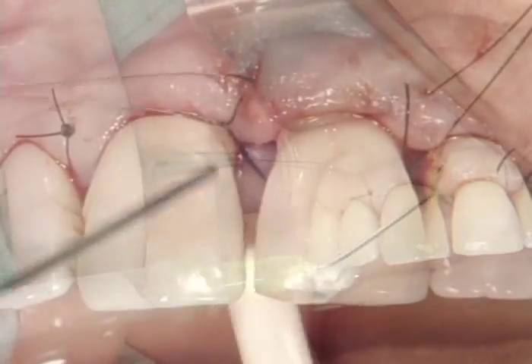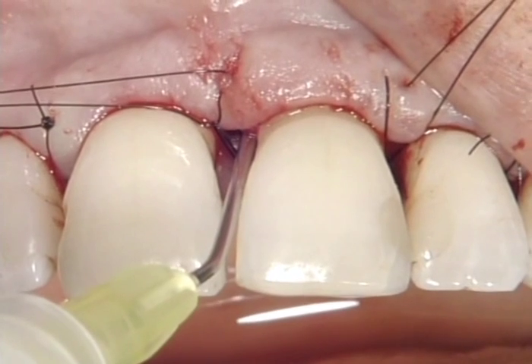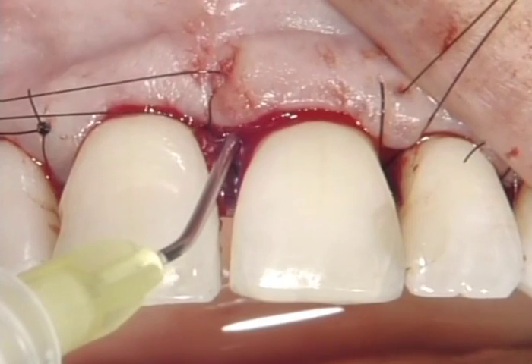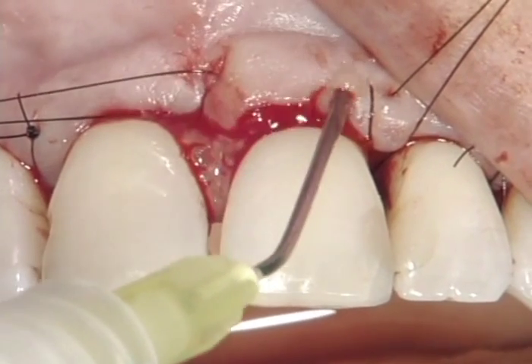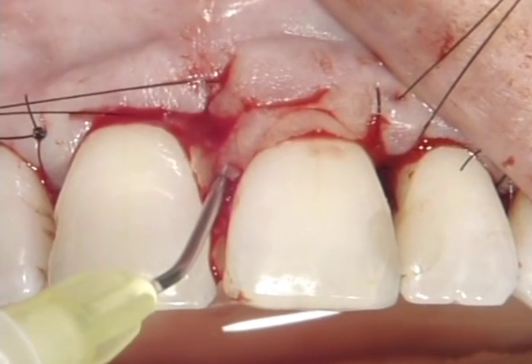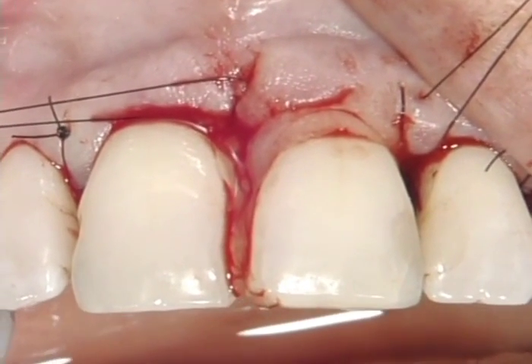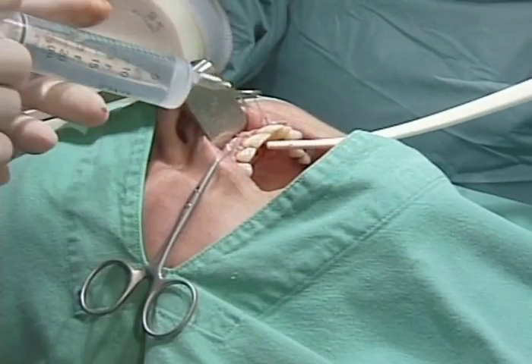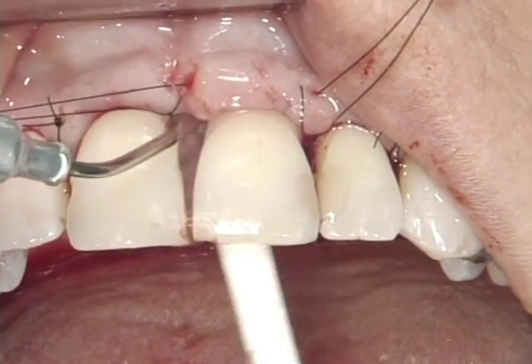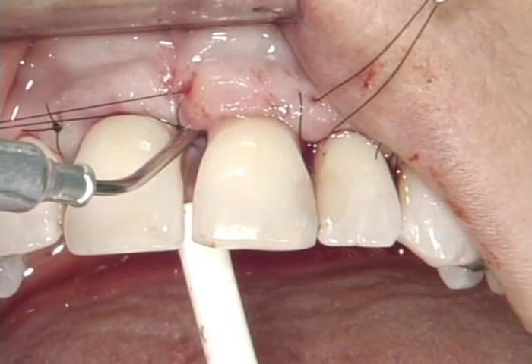PREF gel is applied now. The needle is inserted down to the bottom of the defect. The PREF gel is then left in the defect for 2 minutes to remove the smear layer by root surface conditioning. Excess PREF gel flows out at the edge of the gingiva. After 2 minutes, the site is rinsed again with sterile saline solution. All contact with blood, or especially saliva, on the root surface should be avoided.